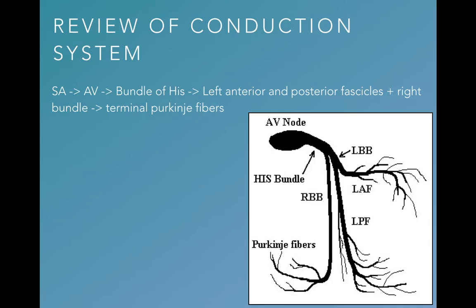If it's a block of everything, you would just call that a left or a right bundle branch block. If it's a fascicle, then it's called a hemiblock. So you can imagine there's a lot of different combinations as to where the blocks can occur, and it gets pretty complicated. But again, I'm keeping this lecture as simple as possible, so I'm only going to talk about AV blocks and left and right bundle branch blocks.